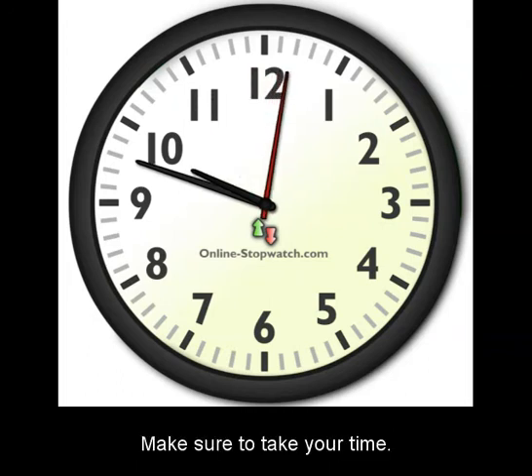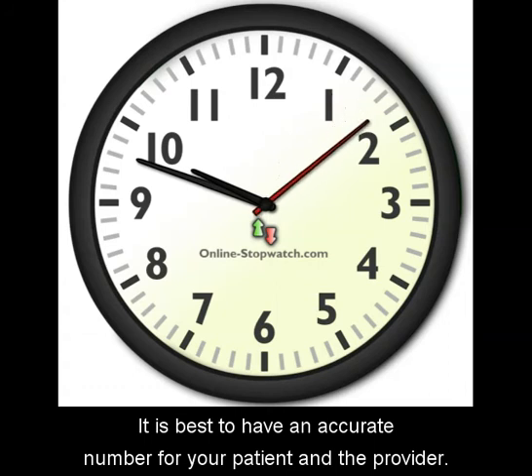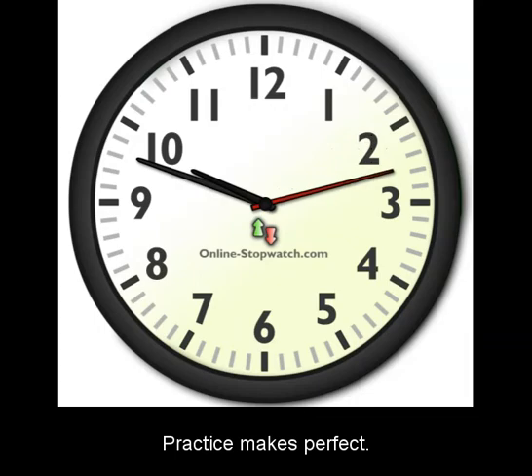Make sure to take your time. If you have to begin over, it is okay. It is best to have an accurate number for your patient and the provider. Practice makes perfect.